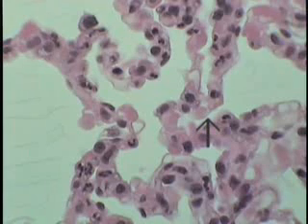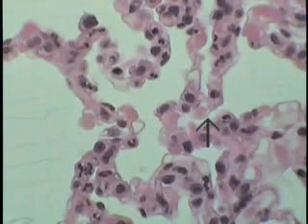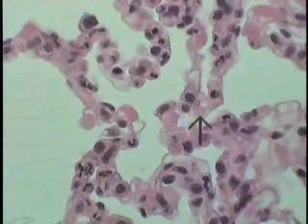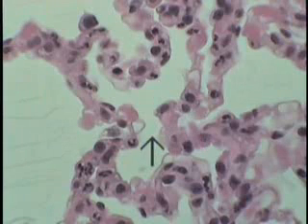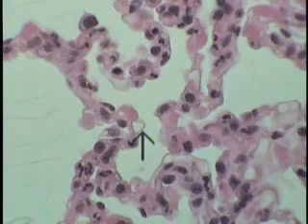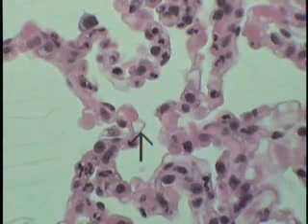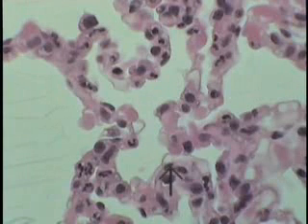So this little dark interface is that blood-air barrier, consisting once again of a type 1 pneumocyte, the cytoplasm thereof, basement membranes perhaps fused in between, and then the endothelial cell cytoplasm lining the alveolar capillary, which is here. So this gives you again another good indication of the extraordinary nature of this barrier. This is an empty capillary shown here where it bulges out somewhat, and you can see the erythrocytes that were coursing through and were coming in this direction. And here's another example of that barrier showing here, this very thin line.